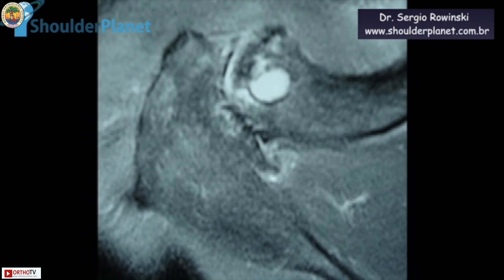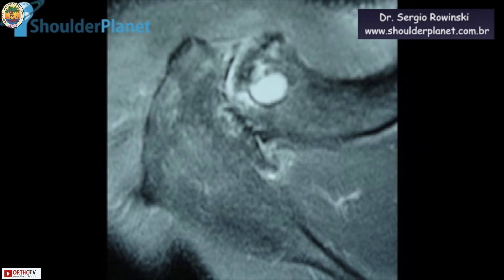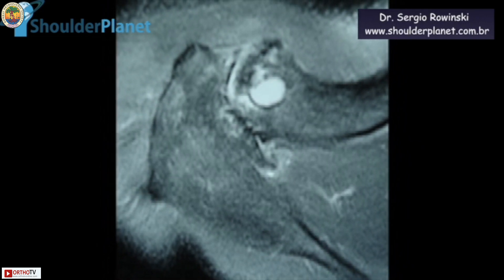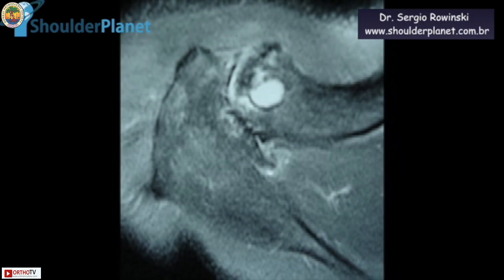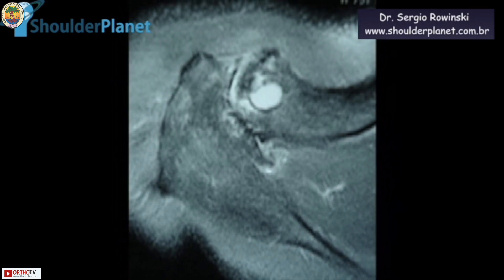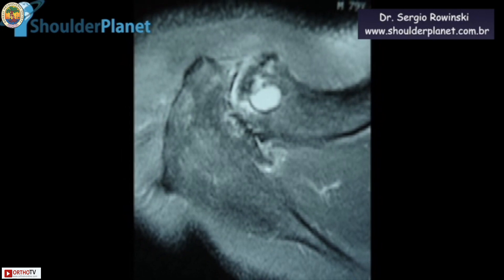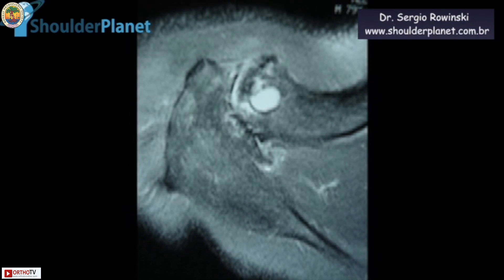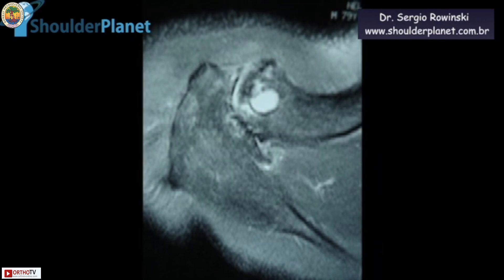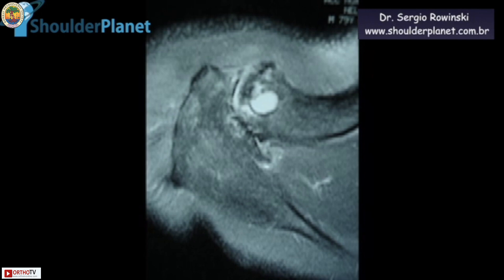We tried conservative treatment for about two months, but with absolutely no result, which was quite expected in such a case. At that point we indicated arthroscopy, which was performed about three weeks ago. This is his arthroscopy that we are now seeing.